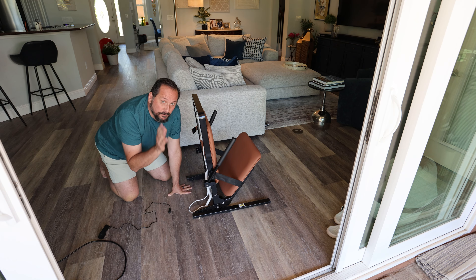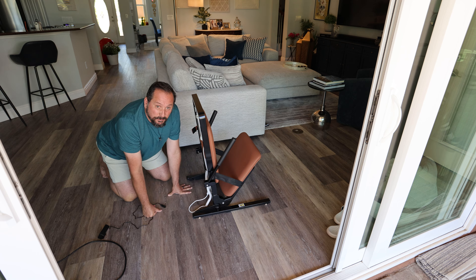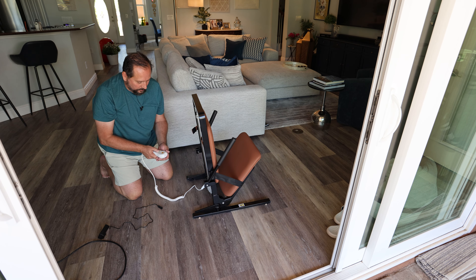The remote is stored in the pocket here. Better than I thought — I couldn't find the plug for the power supply because it's battery charged and battery operated. I don't know if it came with a little bit of a charge or not. Let's see — we press the button — oh, it did!